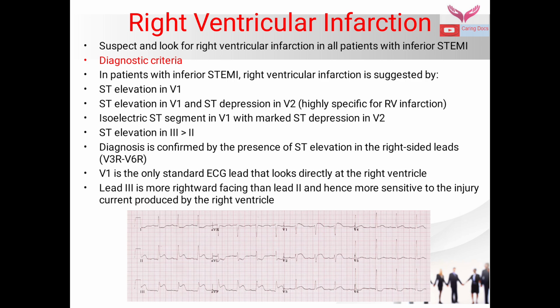Isoelectric ST segment in V1 with marked ST depression in V2, and ST elevation in lead 3 more than lead 2. Diagnosis is confirmed by the presence of ST elevation in the right-sided leads, that is V3R to V6R. V1 is the only standard ECG lead that looks directly at the right ventricle. Lead 3 is more rightward facing than lead 2 and hence more sensitive to the injury current produced by the right ventricle.